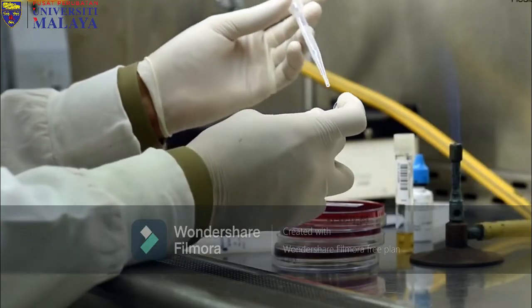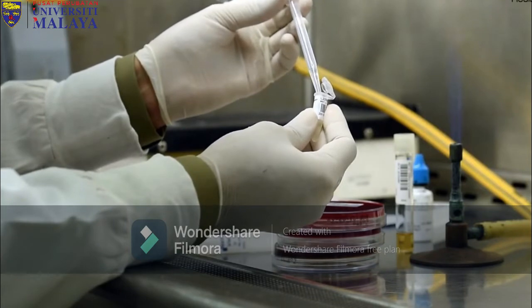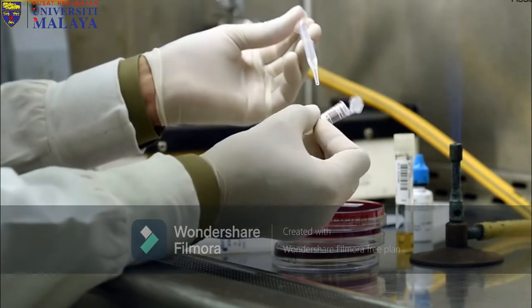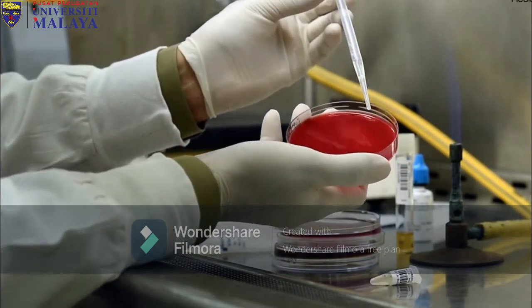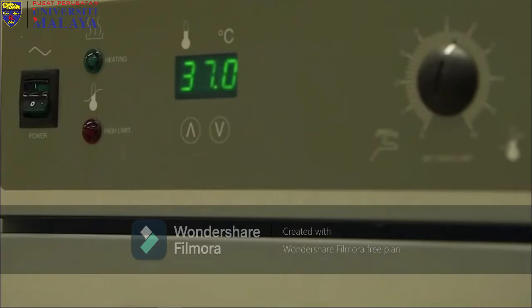After the specimen has been centrifuged, the supernatant should be drawn off with a Pasteur pipette. Place 1 to 2 drops of sediment on the agar plate and smear preparation. Then incubate the agar plates at 37 degrees Celsius in 5% carbon dioxide.